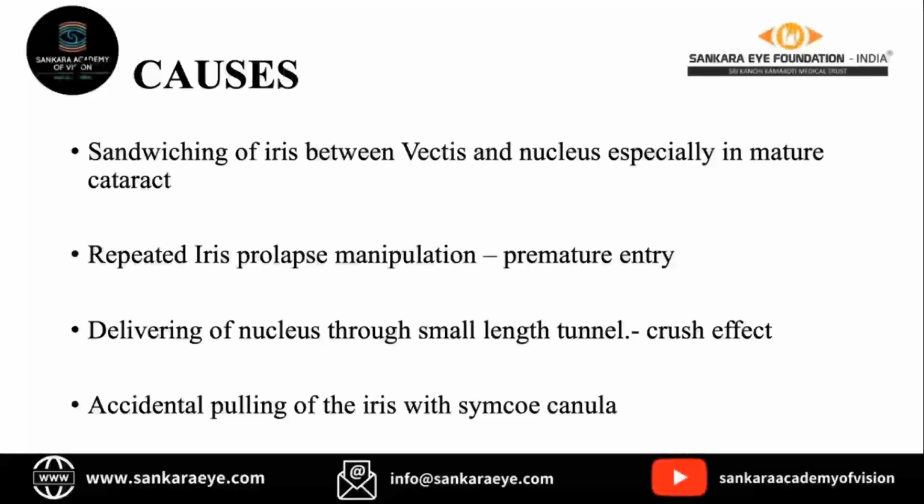What happens if you're delivering a big nucleus through a small tunnel? It would press on the iris, and when you're delivering, it might come through, leading to iridodialysis. Sometimes accidentally, you might pull the iris while doing cortical aspiration, especially when the cortex is below the iris.